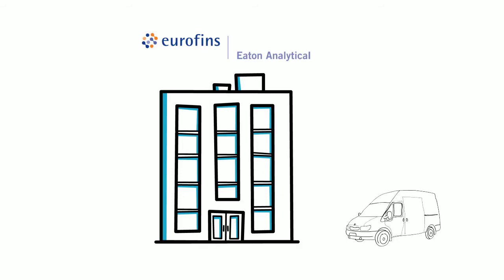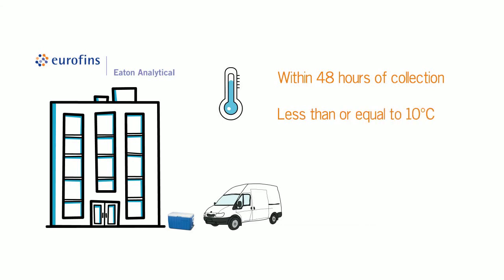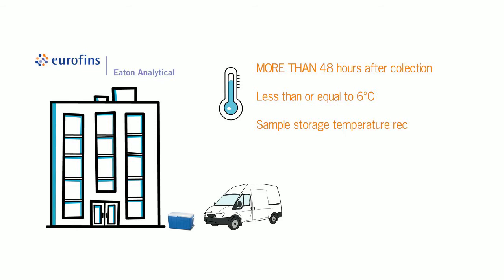Samples should be shipped to the lab on the same day they are collected if possible. If samples are kept overnight before shipping or are going to be received at the lab within 48 hours after collection, they must be on ice or refrigerated to less than or equal to 10 degrees Celsius. In cases where your samples are received more than 48 hours after collection, they must be at less than or equal to 6 degrees Celsius. It is also crucial that temperature records are kept of sampling storage temperature before shipment and recorded on the chain of custody for those samples delivered more than 48 hours after collection.